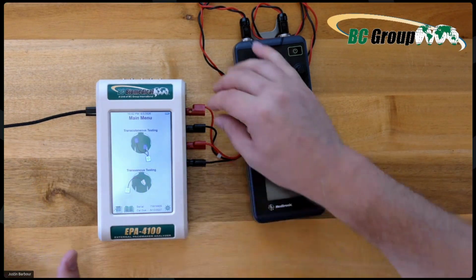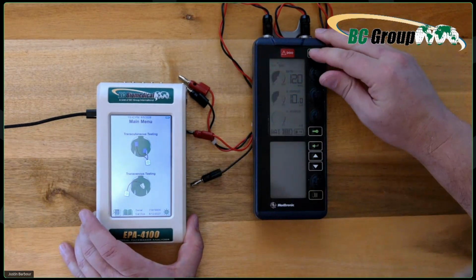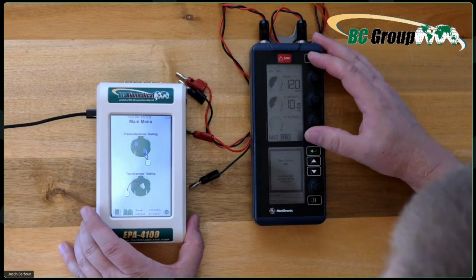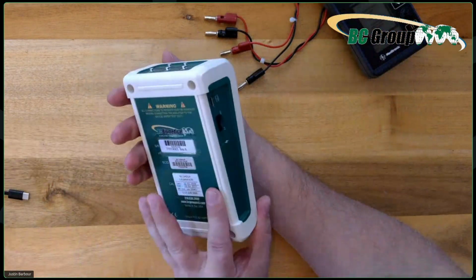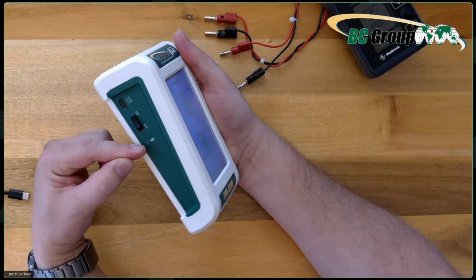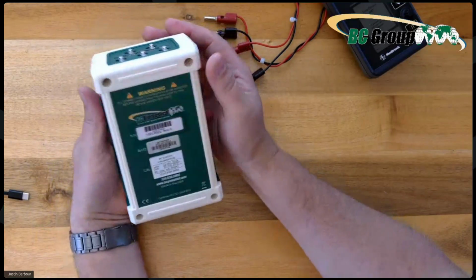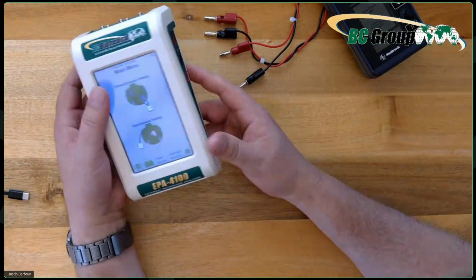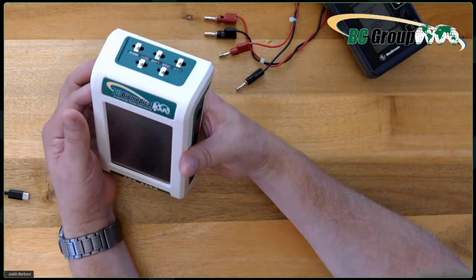So anyway, guys, this here is the EPA-4100. That is the External Pacemaker Analyzer 4100. I'm going to be doing probably several more videos on it. It is battery powered. It's got a lithium-ion battery cell in it, and you also have a charge indicator right here showing you what's going on. Switch shuts it off quickly and easily, and here on the back we have a spot for our calibration stamp. But that is the final version of the product for hardware. So I just want you guys to get a first look.